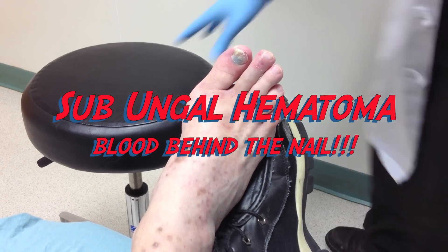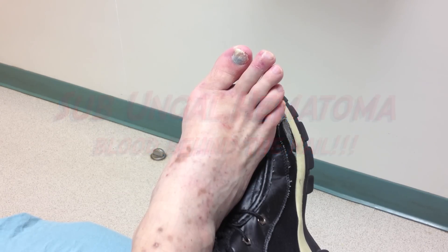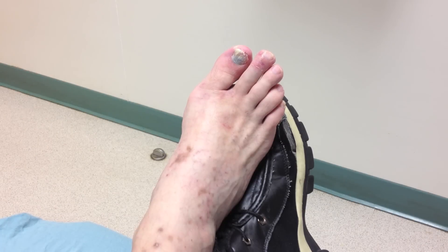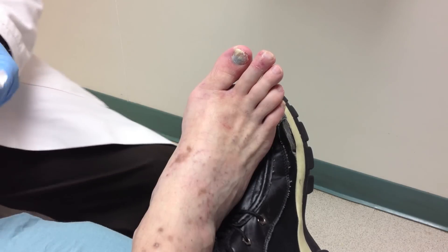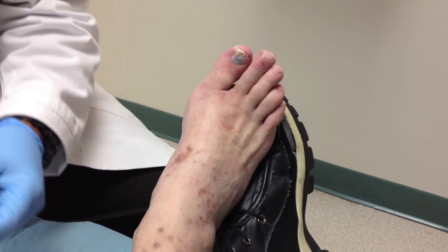We're here with this gentleman who had a table fall right on his toe and he sustained what you can see there — a subungual hematoma, blood beneath the nail. That's a relatively small one, about thirty percent of the nail, and it happened a couple hours ago so the blood should be nice and fresh. When people wait too long, it coagulates and gets hard and won't come out.